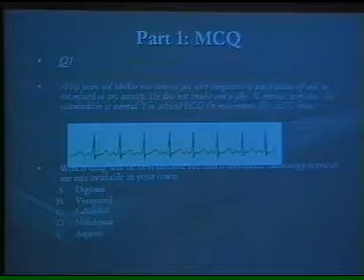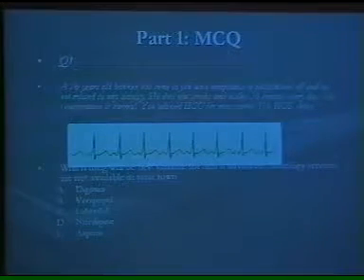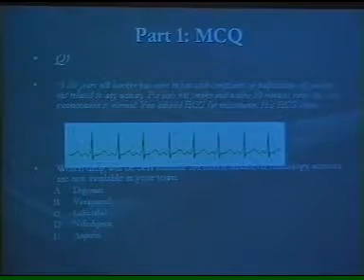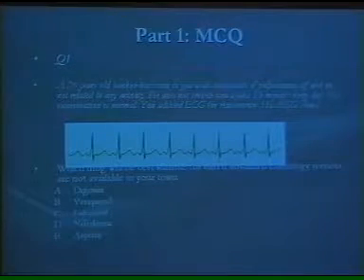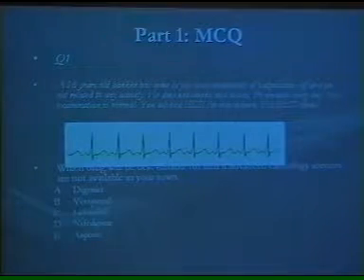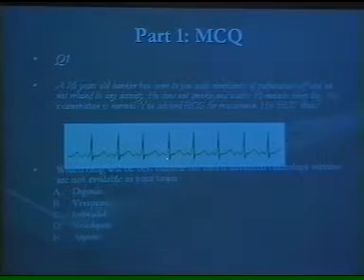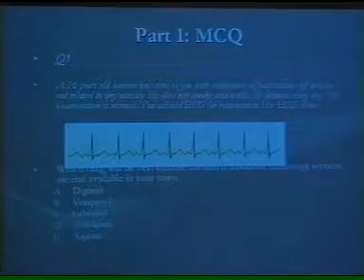I will not ask you what the question is. Just to give you a flavor that this can be asked. Can anybody tell briefly just one point in this ECG? Anything significant? So you will see this. Remember this ECG. I think you will see this ECG when Professor Masood discusses ECG. These are slides running on PowerPoint. This is called a delta wave. You'll see this. What is a delta wave? And you can write this question.